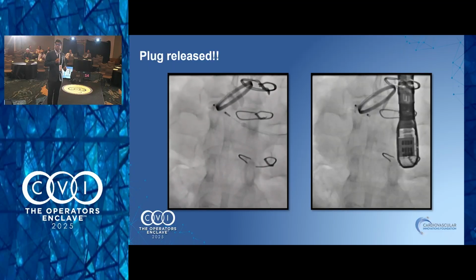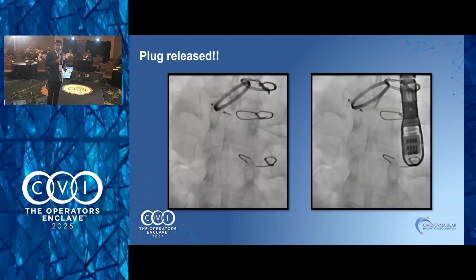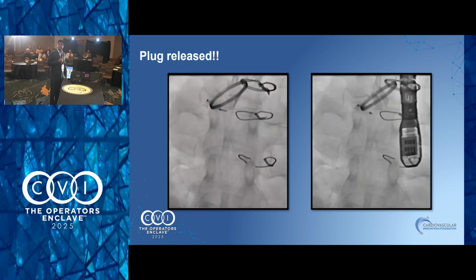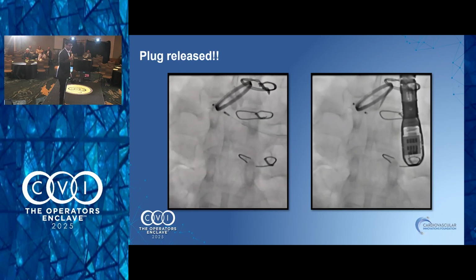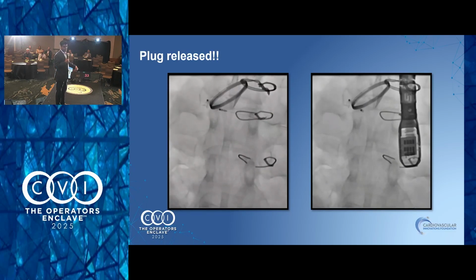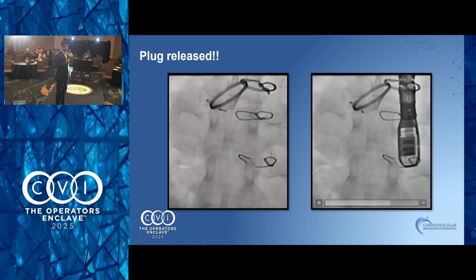And that's why I chose the 6, because I didn't want to put a big plug in with the discs on the LV side that will just interact with the leaflets. You also didn't have an anchor wire, so you're pretty confident. We said, that's it. As I said, it was 3 hours. Even after transapical, we thought, this will be easy peasy, we'll cross, put a plug in, we'll come out. But after like 2.5 hours, it was just such a small neck that we're just going to try one plug. If it works, it works.